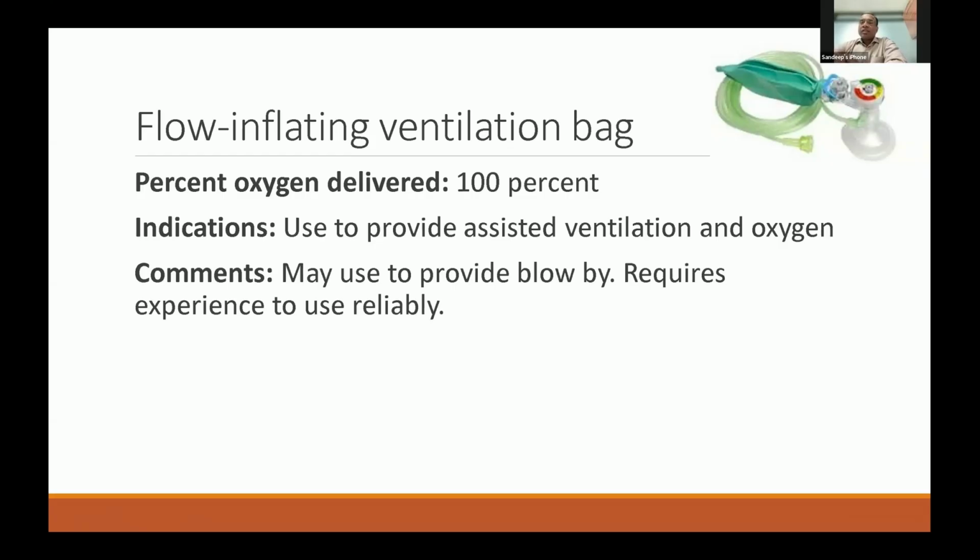At least with a self-inflating bag, you will be able to ventilate, and even without oxygen you can give at least 21% oxygen. With this collapsing bag, which is dependent on oxygen or airflow for ventilation, you cannot do anything, right? So the self-inflating bag system is very, very important.